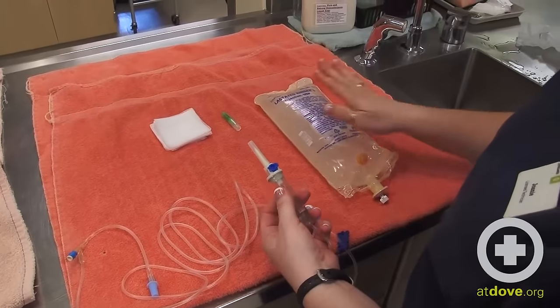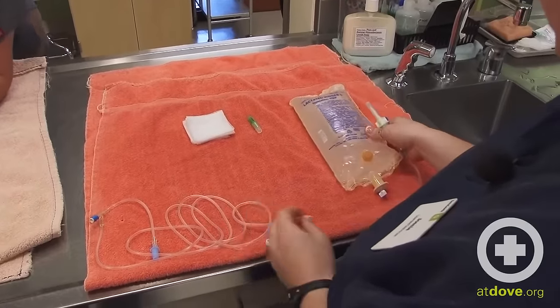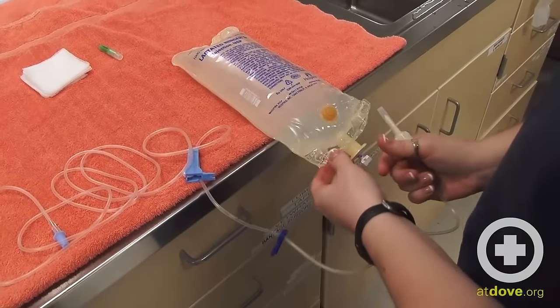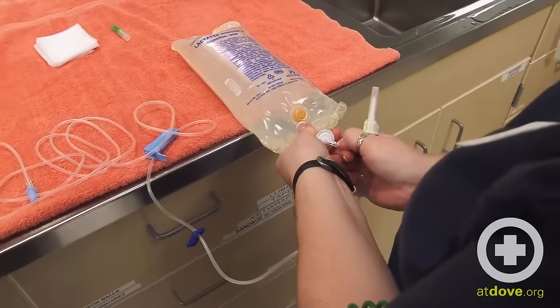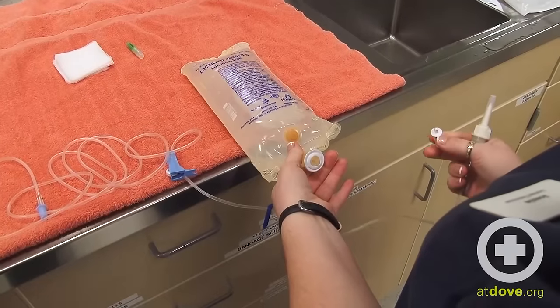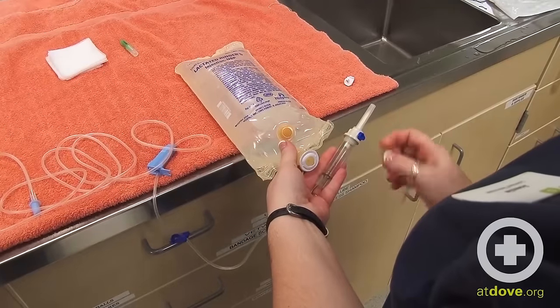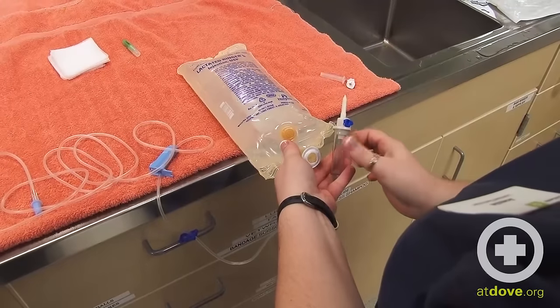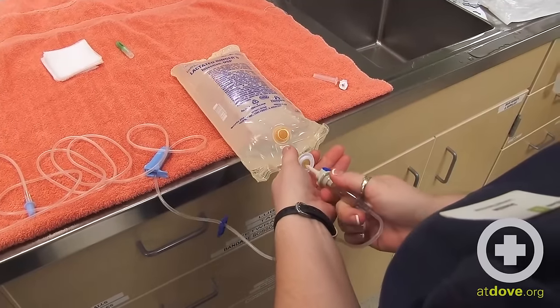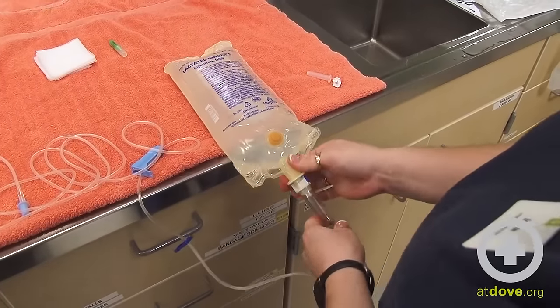This is the spike end that goes into our fluid bag. On my administration set I'm going to clamp it, and then pull my fluid bag off the edge of the table to get access to this plug. If you pull on this plug, that opens up an area where you can spike the bag — you don't want to touch that area, you want to keep it nice and clean. When you go to spike, pull off the end cap of the spike as well, then push it into the hole pretty hard until it's nice and flush.